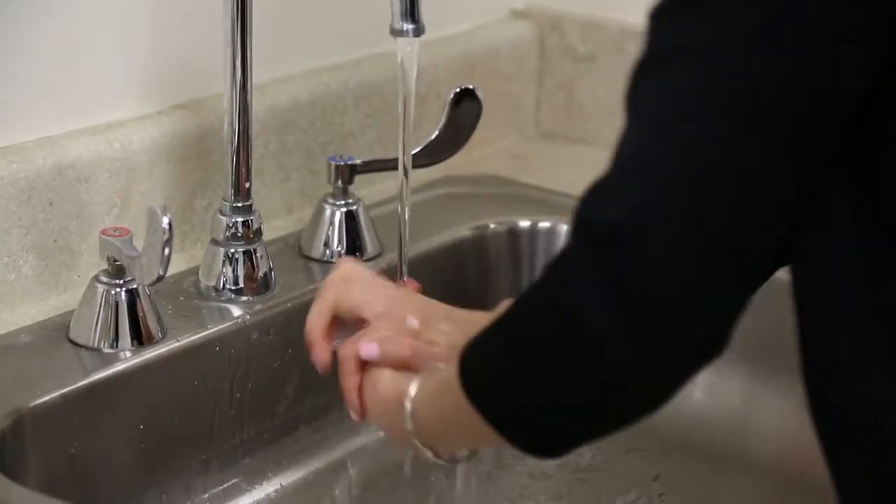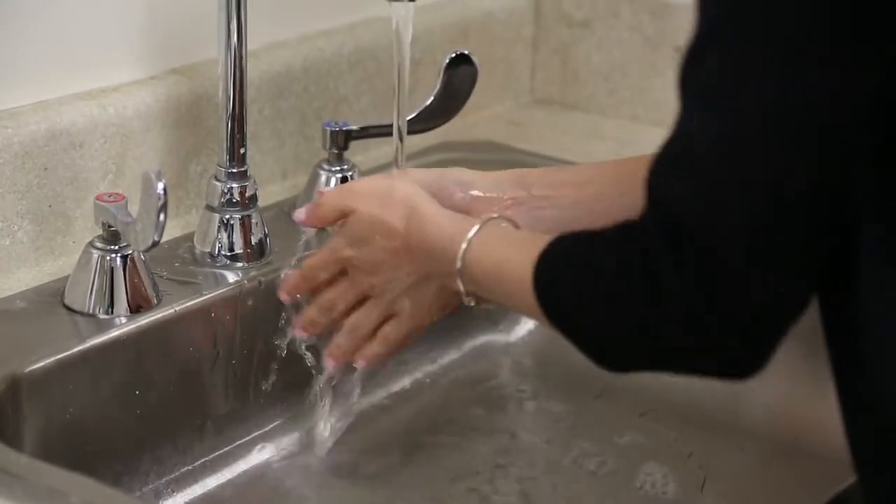This video is designed for the insertion, removal, and care of your new rigid gas permeable contact lenses. The first thing that you must do is wash and dry your hands thoroughly.